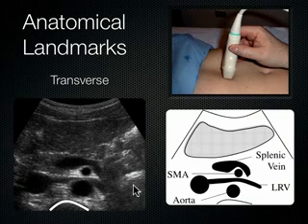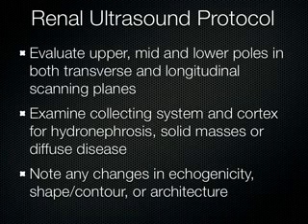So here's the left kidney, not seen on the screen. It's over on this side of the body somewhere. Its blood supply is sort of analogous to the right side of the body where we just were, where the right renal artery had to go behind the IVC. On the left side, the left renal vein has to get over to the right side of the body to drain into the IVC. The way it does that is it gets nut-cracked between the aorta and SMA and gets into the IVC. Cool?